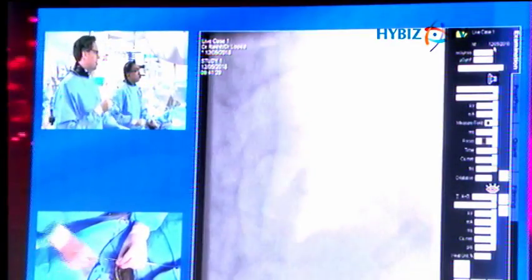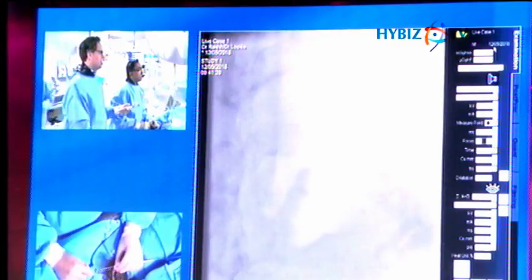It obviously has some outward exerting force. There have been over 2,000 patients in registries and randomized trials, and a lot of them have got imaging follow-up, and there isn't the evidence of ongoing expansion and disruption of the vessel. It really opposes the wall. It's not designed to actually expand or dilate up a lesion, which is why pre and post preparation is so essential.